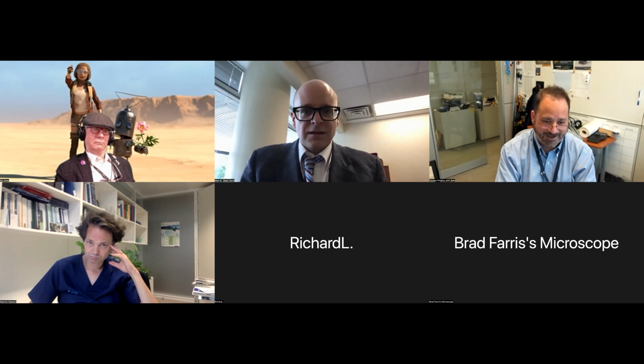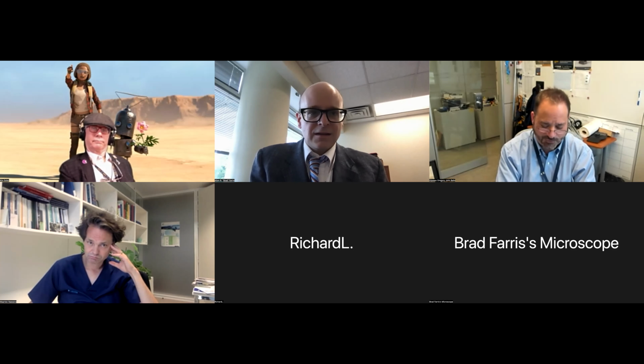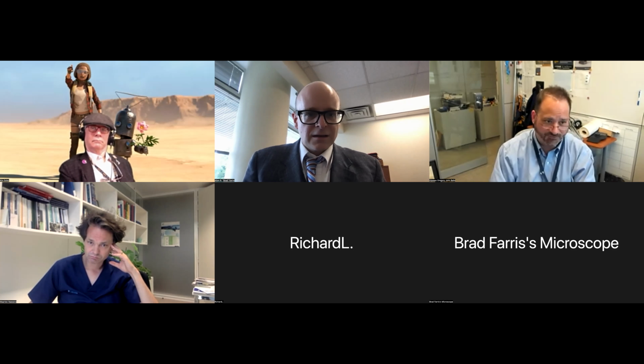That's really amazing. So any of you who doubt this can just directly, since I'm the author of the tool and didn't use it as much, ask Charlie Alpers or Laura Barsoni what their experience was, because they've labeled thousands of tubules with this tool at this point.